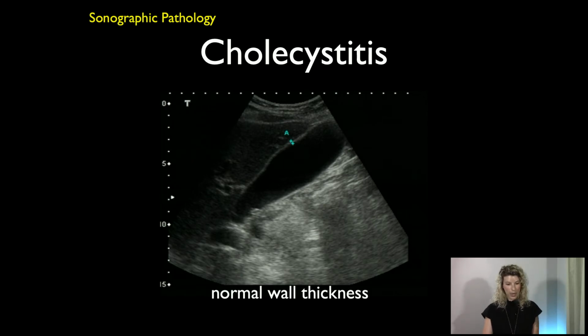So you're measuring the gallbladder wall here at the most anterior part. You could even go higher than this, but anything along this wall is fine, right where it touches the liver. You're measuring from the most outside part of the wall to the most inside part of the wall, but only in the anterior wall, right? So it's really hard to see because this is a normal gallbladder wall thickness, but this is going from the outer wall to the inner wall.